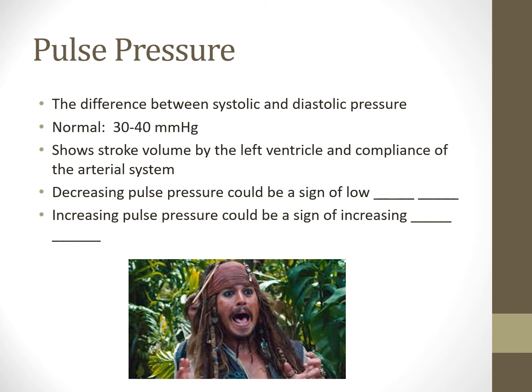Because now, let's say we restrict, let's say their mean arterial pressure is decreased, and that means their oxygen delivery to their brain, to the heart, to their kidneys, to the rest of their organs is compromised, and it could be a big serious issue leading to multi-organ system failure because we were inappropriate with our vent settings. So this is something I want you all to pay attention to. Know and heed what the arterial line and the heart rate is telling you.